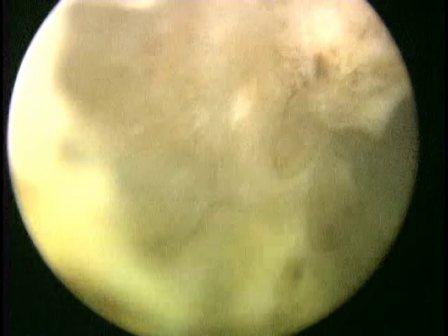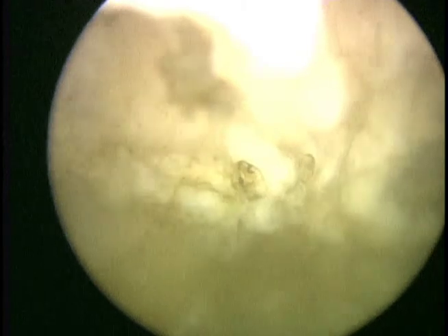This differs than the 7 o'clock groove in the right lobe, as we can see here, quite nicely, a capsule. Even here, you can see that it is even thin at some areas, so care must be made not to go through and vaporize more in these areas, which will obviously lead into capsular perforation. Nevertheless, I still take the time, especially at this right apex, to choke up very close near the verumontanum to vaporize down that remaining tissue.